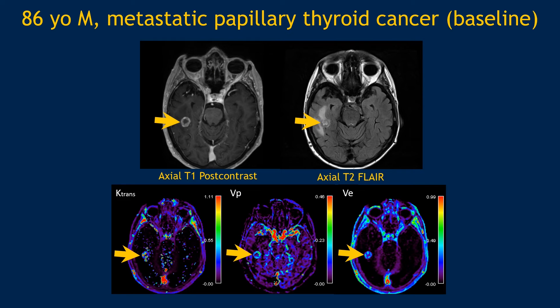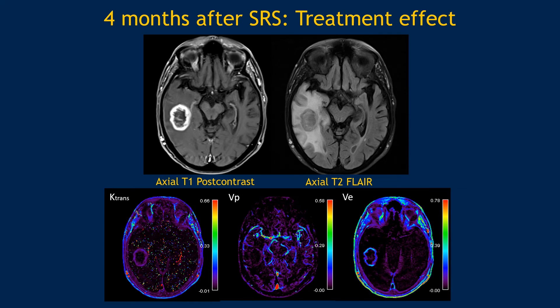This is an example of a patient with a brain lesion that turned out to be papillary thyroid cancer metastasis. The enhancing lesion showing some edema is very high on K-trans, VP, and VE, showing elevated permeability and vascularity. Four months after radiation therapy, post-contrast imaging shows increase in size and significant surrounding edema. However, on perfusion imaging, K-trans appears to have decreased and VP has dramatically decreased overall, suggesting the lesion is much less vascular. This is consistent with radiation effect.